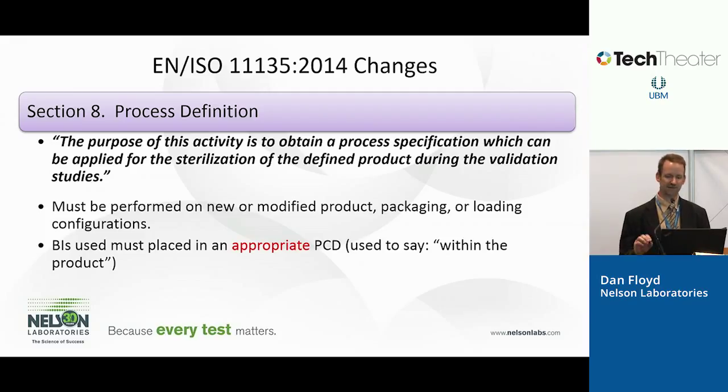It used to say the BIs had to be placed inside the product. Now it allows you to use process challenge devices. It clarifies that. You've always been able to use them, but it just clarifies the fact that you don't always have to use your actual product.